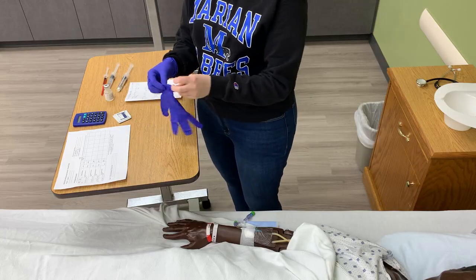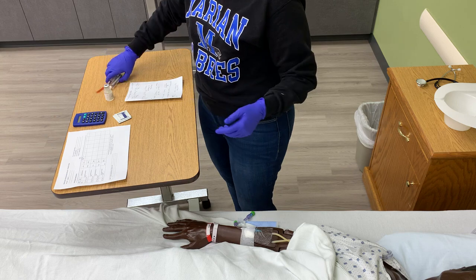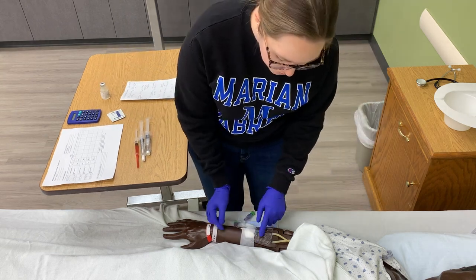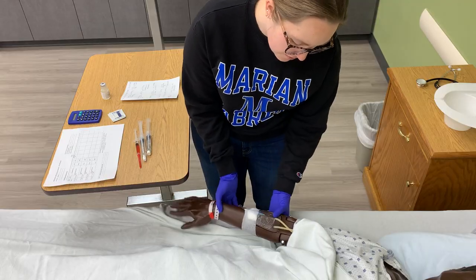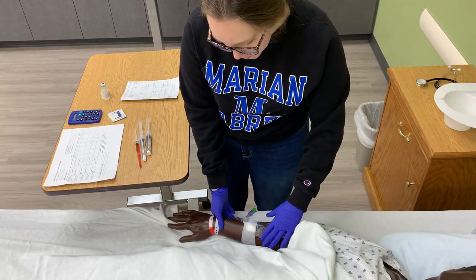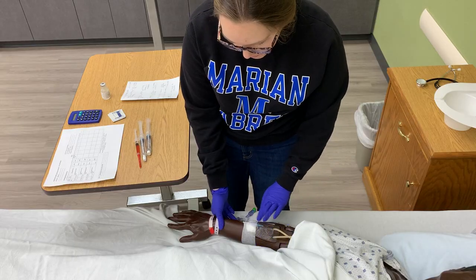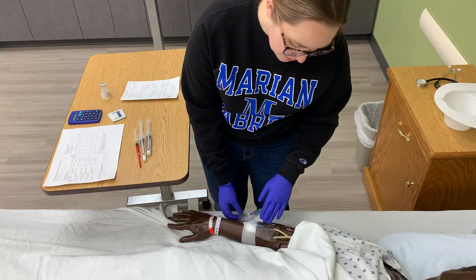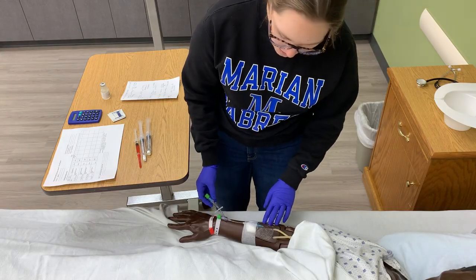So we've got our gloves here. And before we give the medication, I want to assess my site for infiltration or phlebitis. Casey's got the IV in his right arm, so I'm just feeling around. Does that hurt if I palpate here? Casey says no, it feels pretty good. All right, wonderful. I don't see any redness, swelling, coolness, leaking, anything like that.